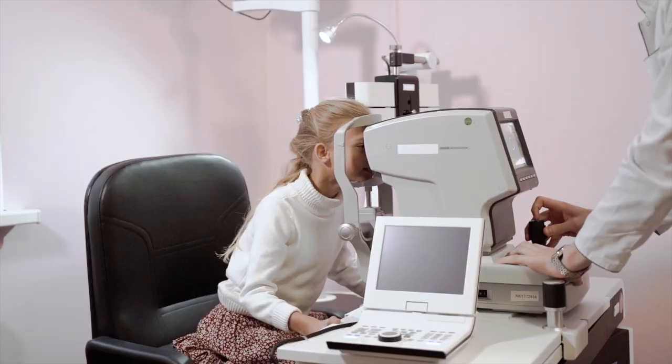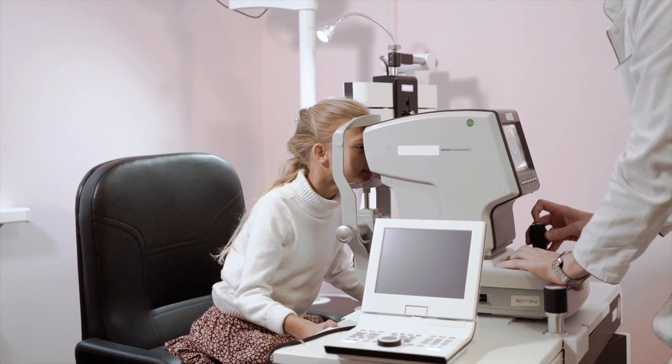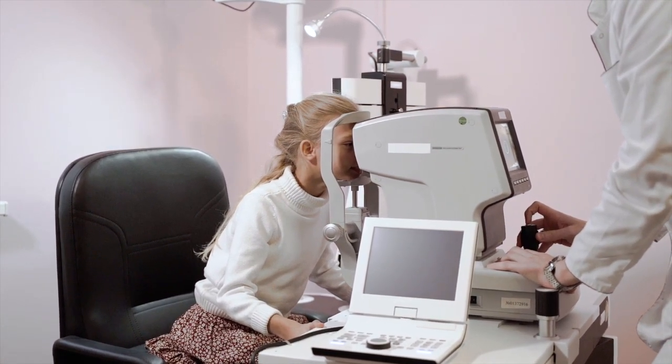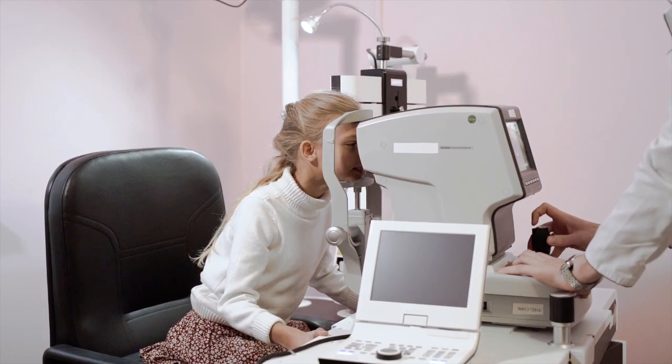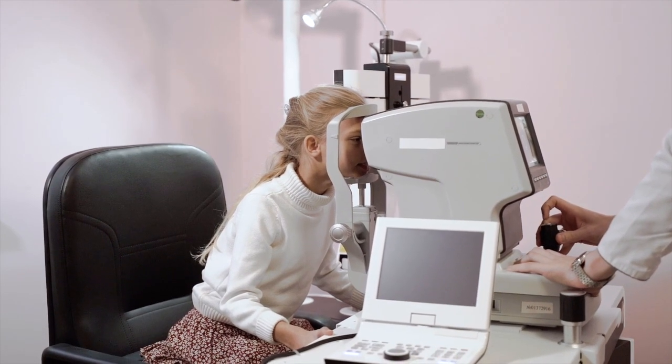Measurement of the ocular dimensions provides key information to your eye care practitioner, who then chooses the appropriate lens material and design. A test called keratometry is performed in order to determine the corneal curvature. The horizontal visible iris diameter, the vertical visible iris diameter, along with the pupil size must be measured. Your eye care practitioner will also measure your blink rate.